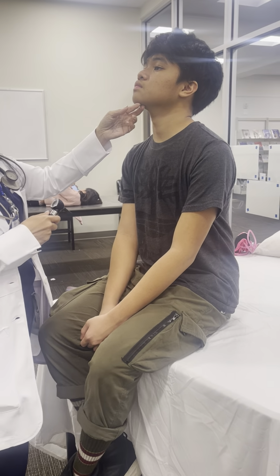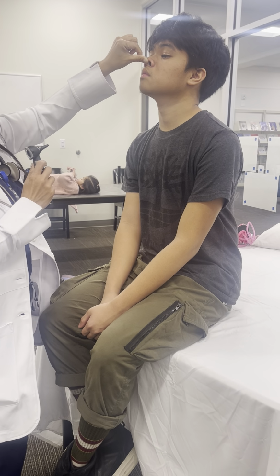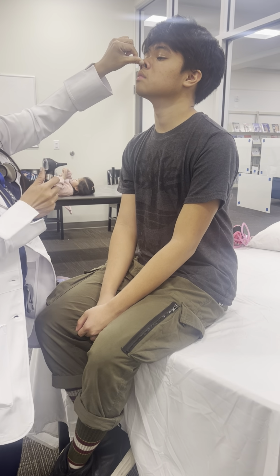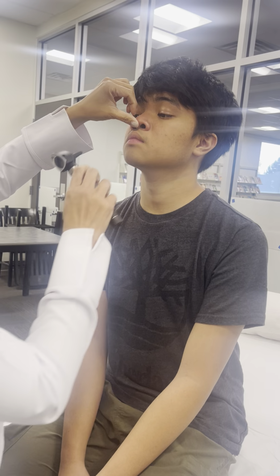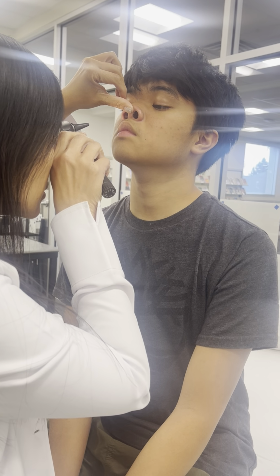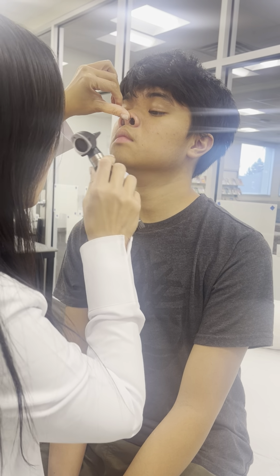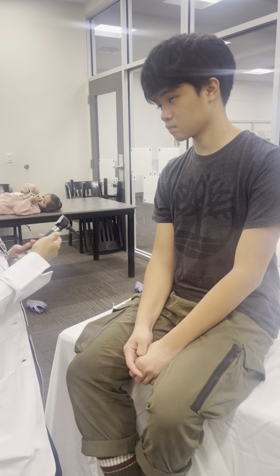With the use of my otoscope, I will turn on the light, and then I will place it inside your nostrils, and then I will look at the mucosa and see if there's any abnormalities, okay? Any problems with your nose? No. Okay, good. So now we're gonna go next to the sinuses.